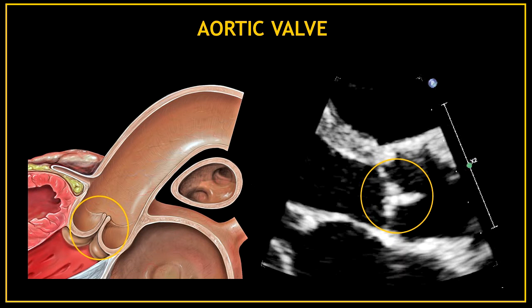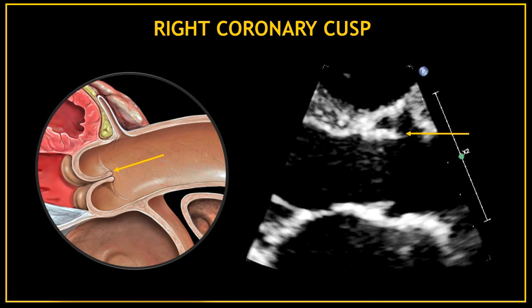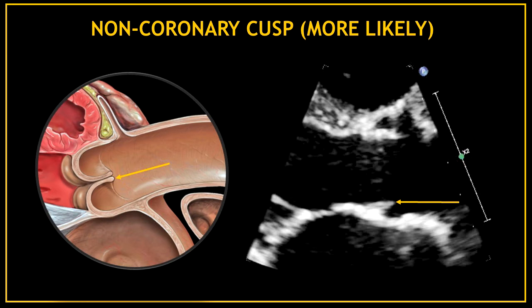Now let's get a closer view. The first valve at the top is the aortic valve — you can see how the valve is closed. When the aortic valve is open we can differentiate the cusps. The first thin line at the top is the right coronary cusp. Depending on the cut, this second line is more likely to be the non-coronary cusp. However, depending on the cut you may also be able to see the left coronary cusp in this view.